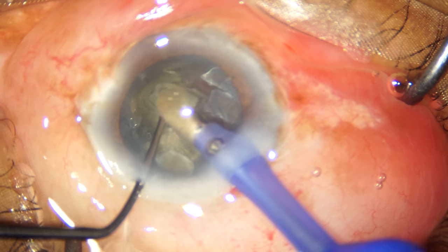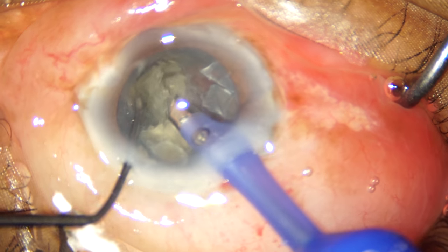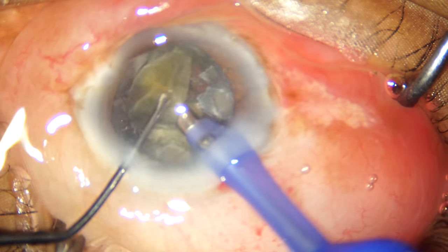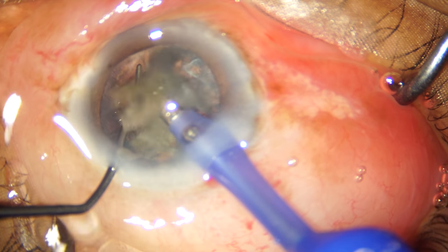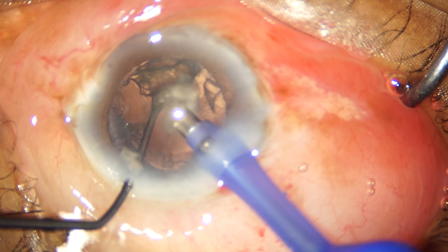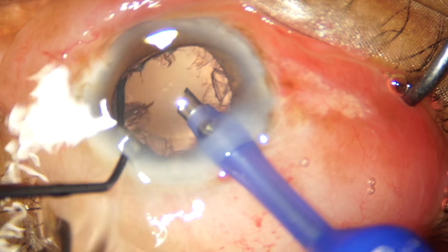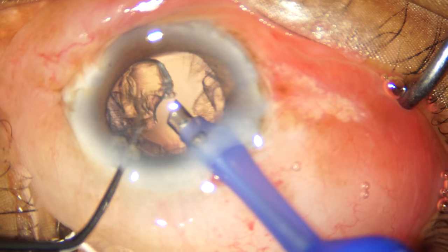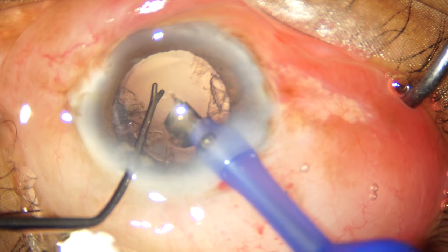This here is part of the posterior plate that was preventing a complete chop, and I finally managed to emulsify it. Some stubborn small pieces hiding behind the iris are further manipulated into the phaco tip and we are almost done with our nucleus emulsification.